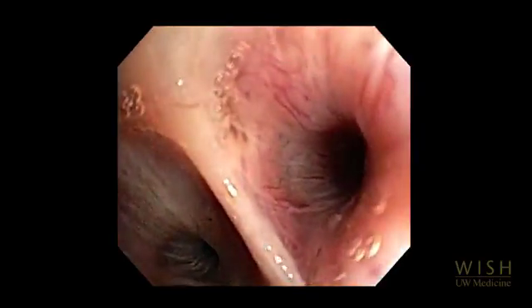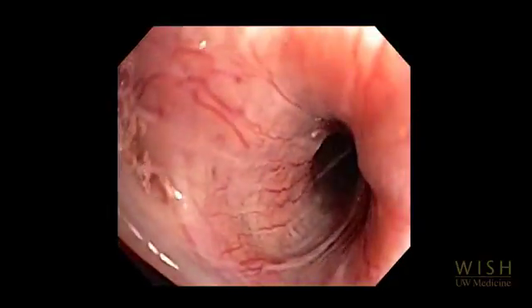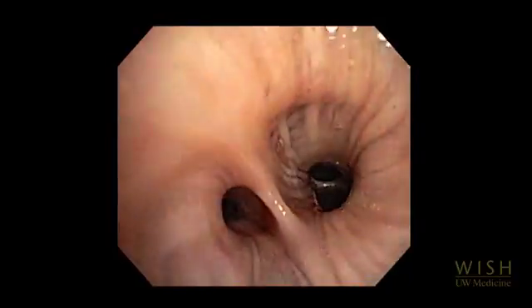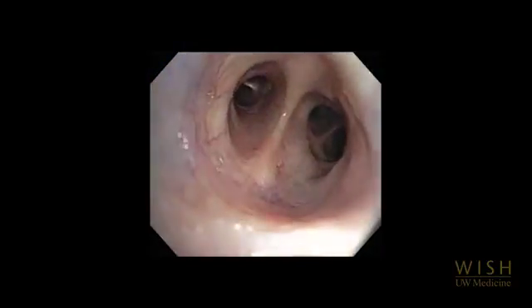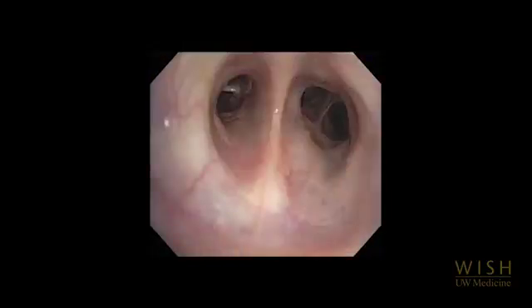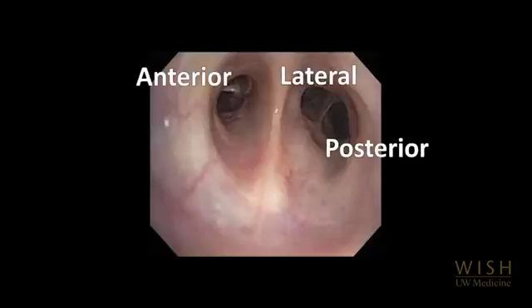The right middle lobe has two segments, medial and lateral. We then inspect the superior segment and then the medial basal segment. Continuing in a different patient, the right lower lobe bronchus divides into the remaining basilar segmental bronchi: anterior, lateral and posterior. These are typically in a row when the bronchoscope is held in anterior-posterior orientation within the right lower lobe bronchus, forming the familiar ALP mnemonic.